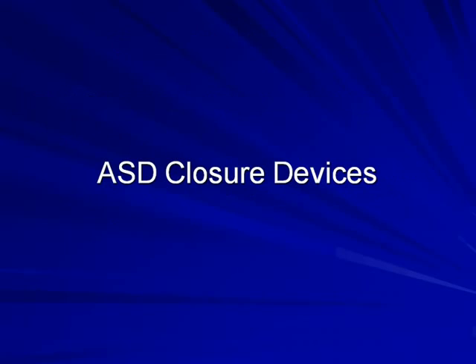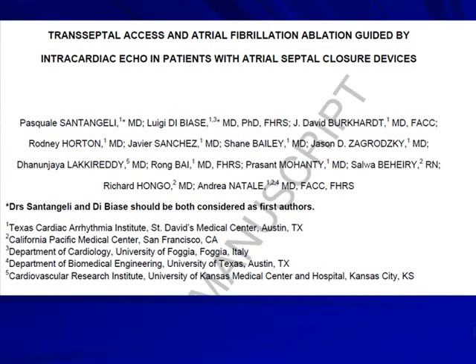So let's talk about ASD closure devices. Here's a manuscript that has been accepted talking about transseptal access. That's actually done through an ASD closure device. That's not the easy way to do it, that's the hard way to do it.